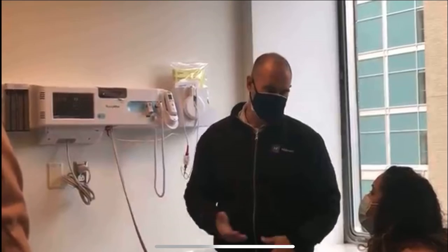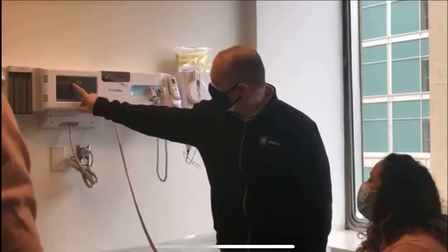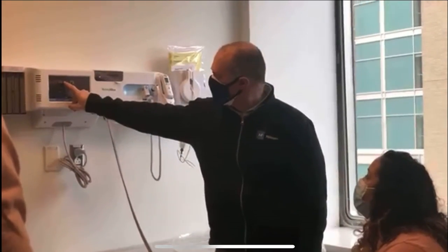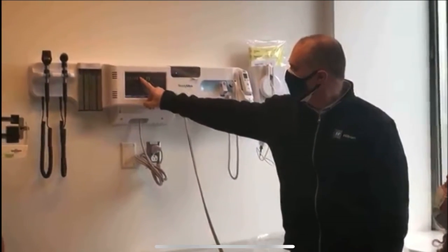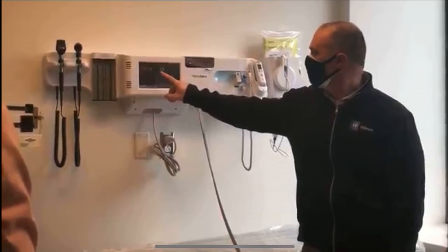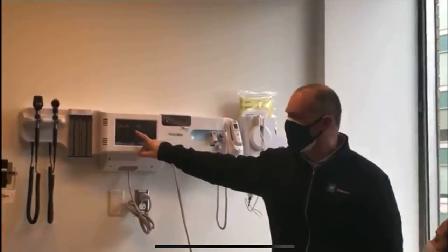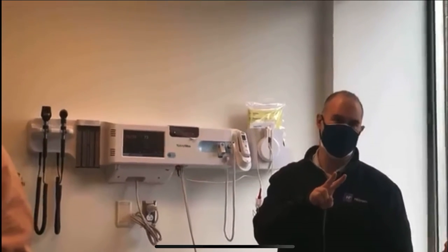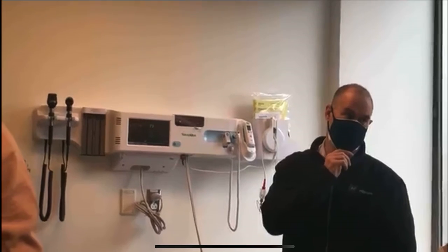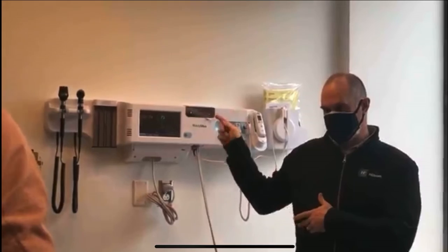So this is the first blood pressure. It's relatively in the same neighborhood as the other one — I would say you don't suffer from white coat hypertension. It recorded the 115 over 78 on the first one, but it put a line through it, so it's not even going to count that one. And now it's counting down — 37 seconds away from taking the next blood pressure, which will count.